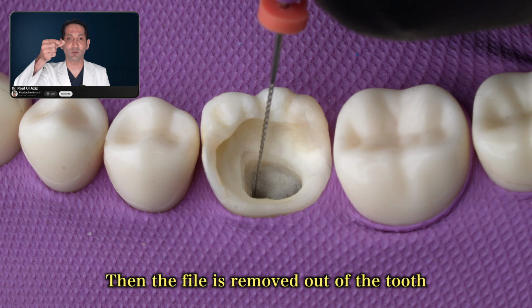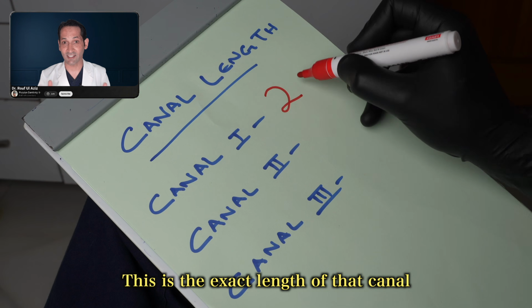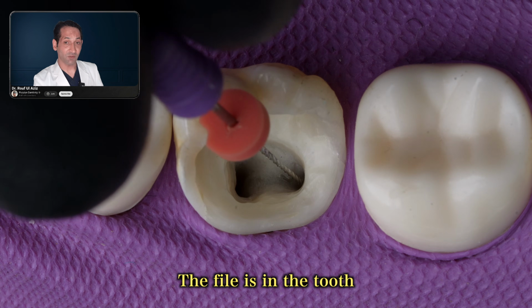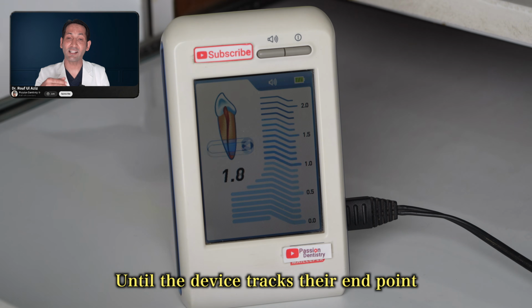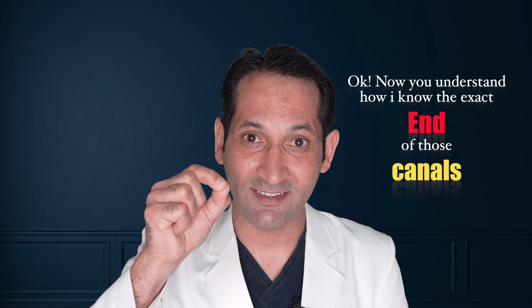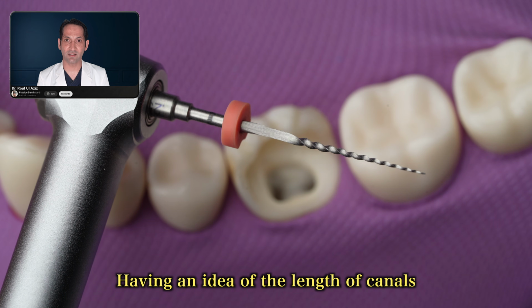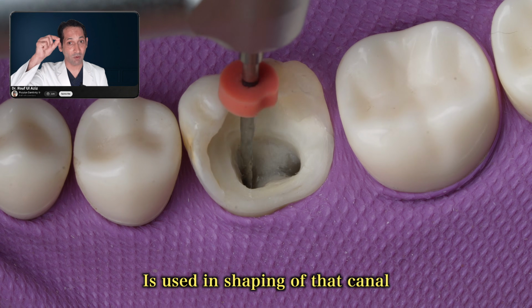Then the file is removed out of the tooth and measured on the scale. This is the exact length of that canal. The same is repeated for the second and the third canal. The file is in the tooth, connect the device, move the file down until the device tracks the end point. Okay, now you understand how I know the exact end of those canals? Good, let's go ahead. Having an idea of the length of canals, a tapered drill of the same length of canal is used in shaping of that canal.